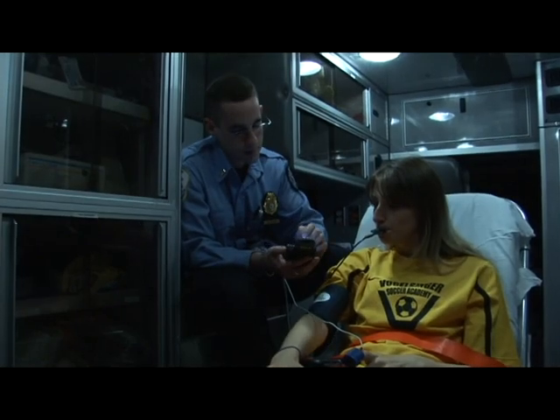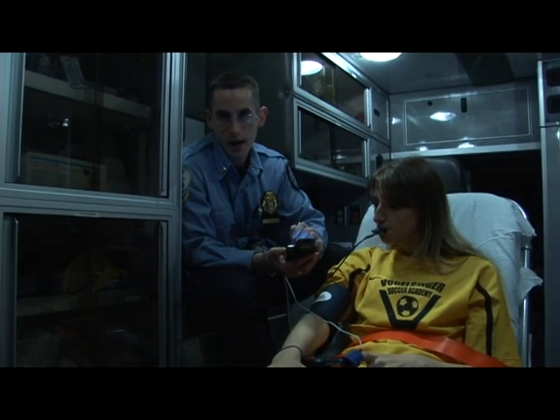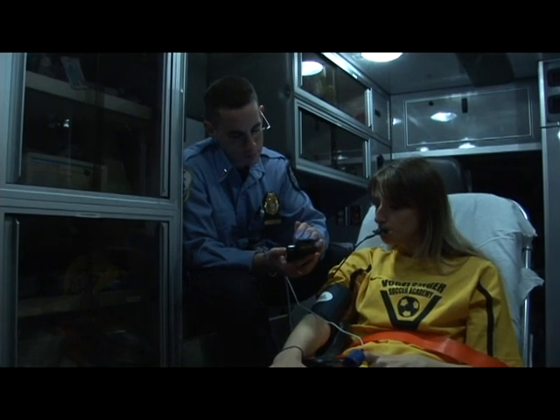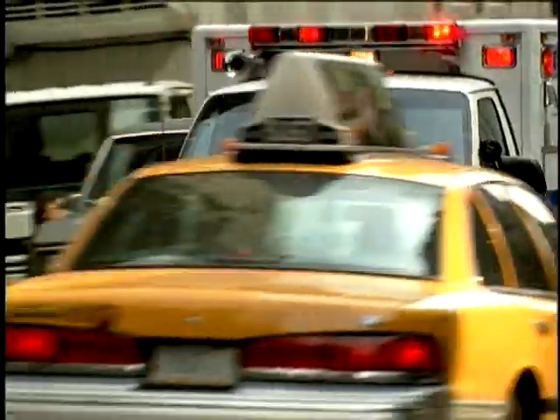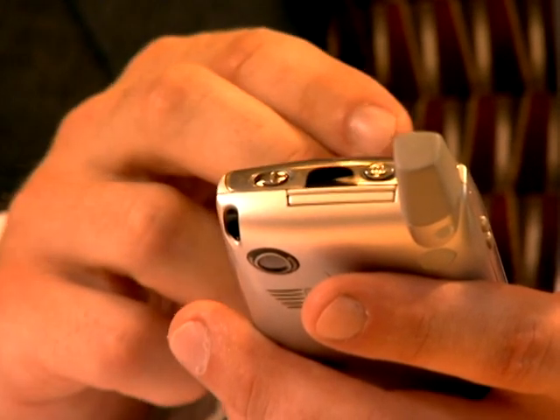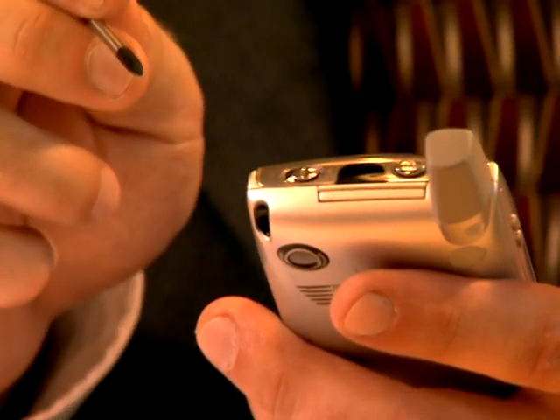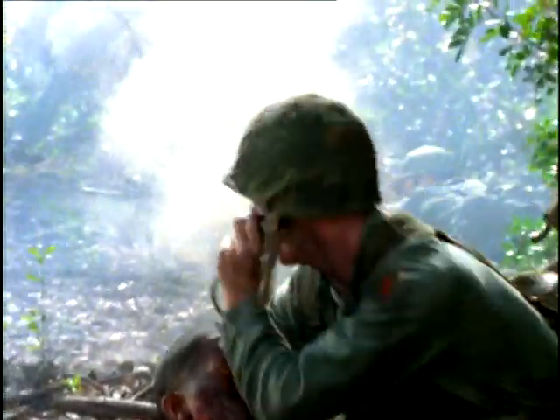The DTA would also be an ideal device for use in ambulances and by other first responders such as police officers. The PDA can connect to the wireless connection in modern ambulances, or a smartphone can be used to operate the device and connect to the hospital database through a GSM data connection. The DTA could also be useful in mass casualty scenarios, military triage, and sporting events.